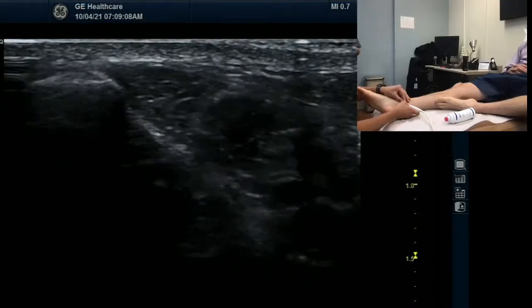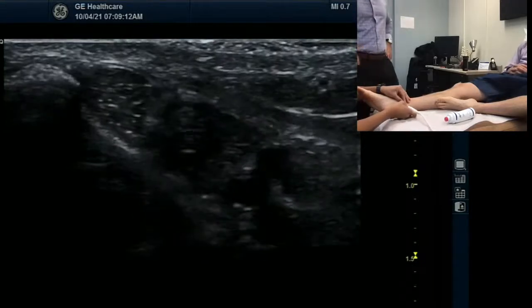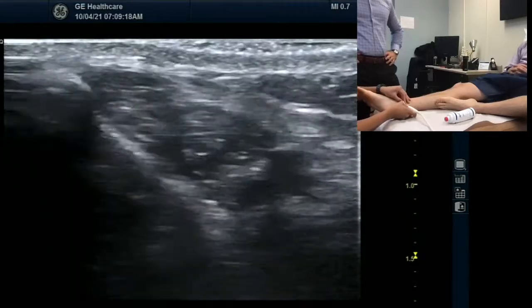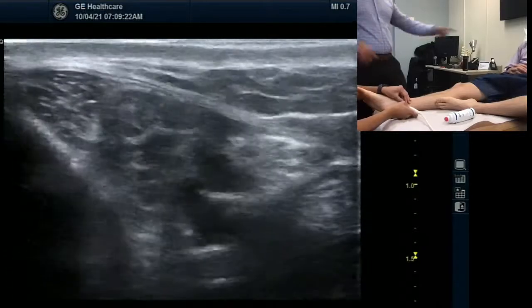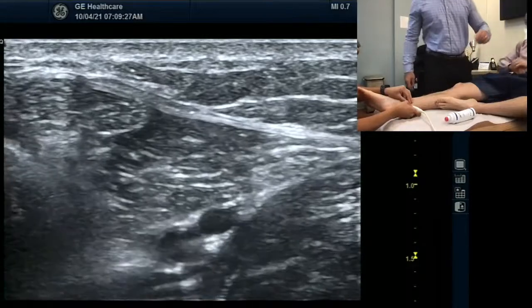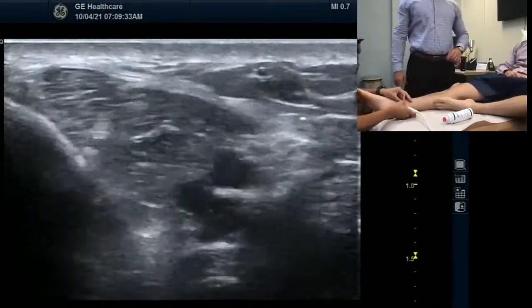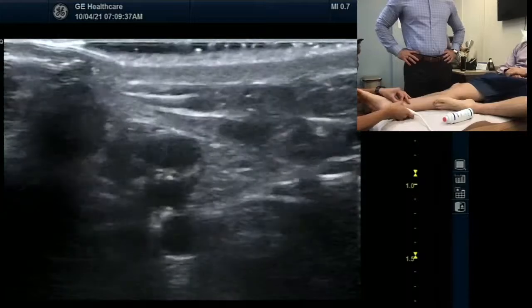We got posterior tibialis, flexor digitorum longus. She's increasing the gain. Deeper in, we'll have flexor hallucis longus. But out here is the neurovascular bundle with the tibial nerve. Do you want to be able to see a little bit more? Let's make it. So Patrick can see, or we can put the machine back.